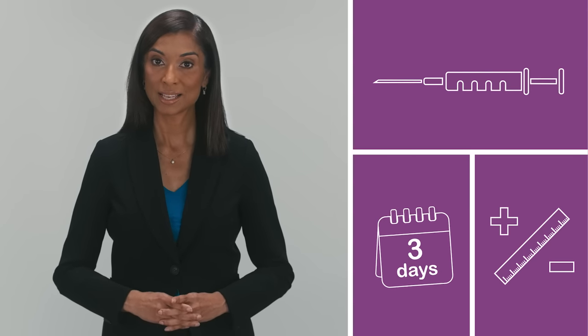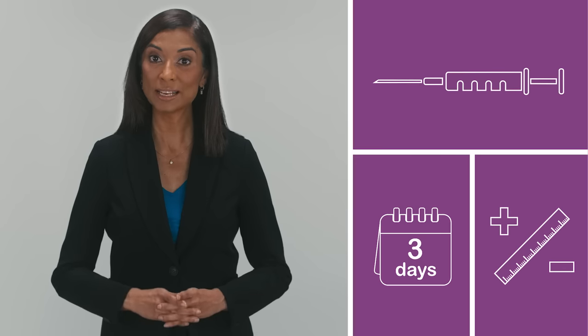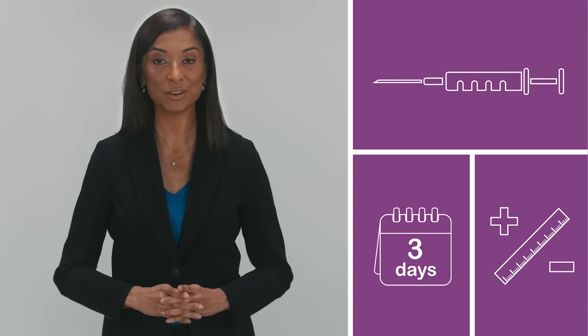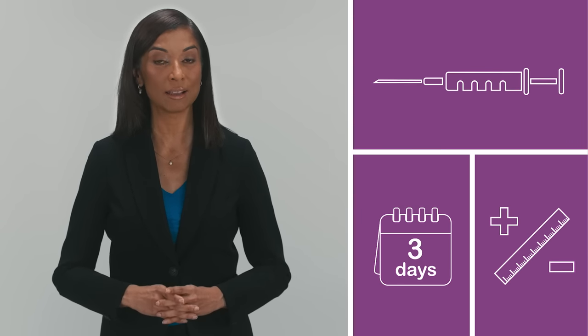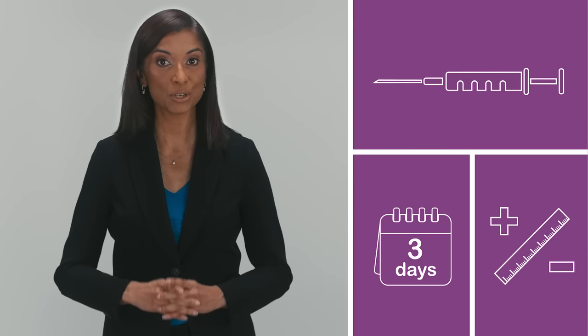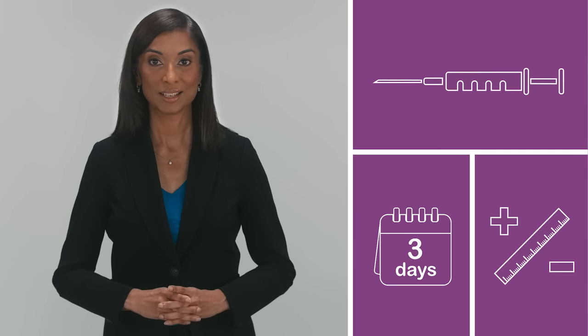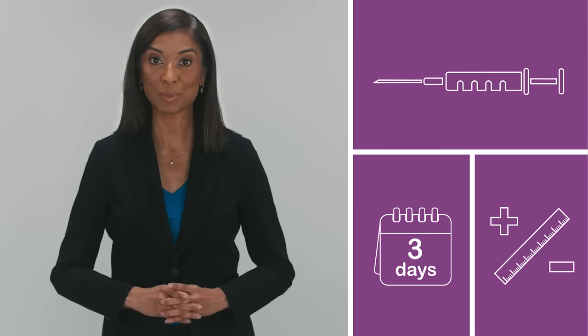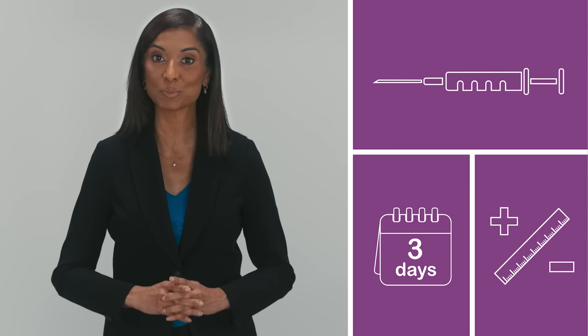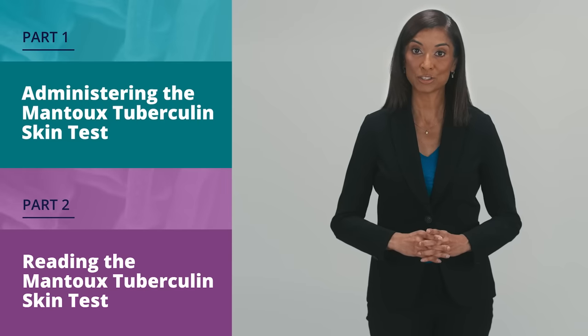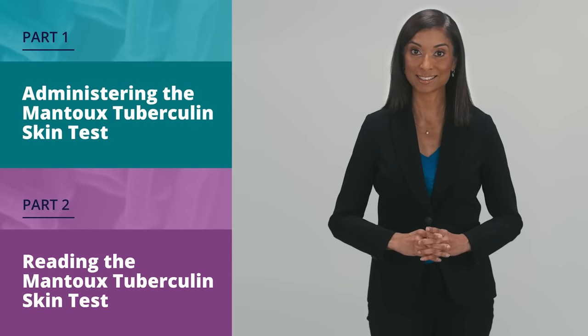The Mantoux tuberculin skin test is administered by a trained healthcare provider who injects a small amount of testing fluid, called tuberculin or purified protein derivative, into the skin on the lower part of the arm. After two to three days, the skin test reaction is then examined by the healthcare provider, who measures any swelling, not redness, where the tuberculin was injected. The measurement is used to determine if the reaction to the test is positive or negative. For the purposes of this training video, only the Mantoux tuberculin skin test will be discussed.